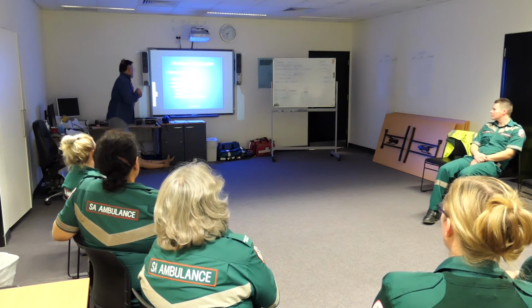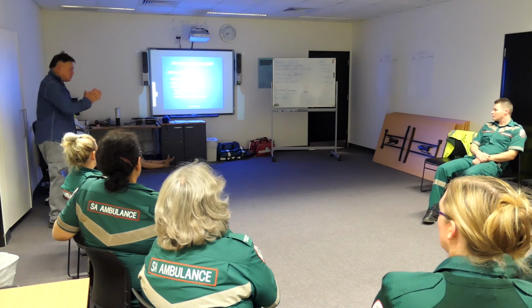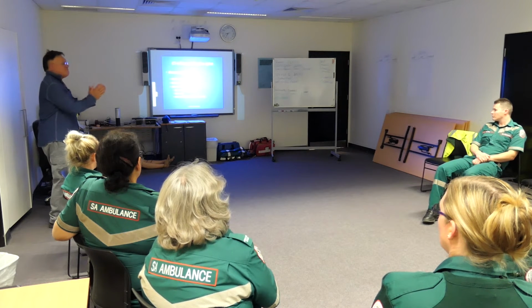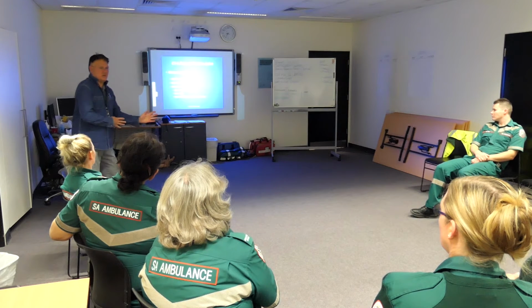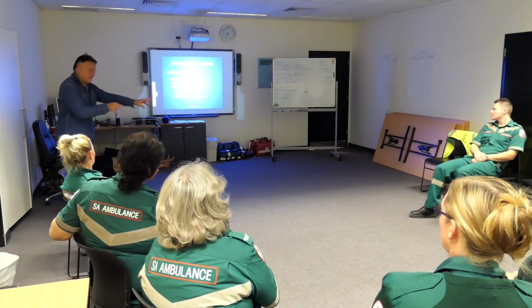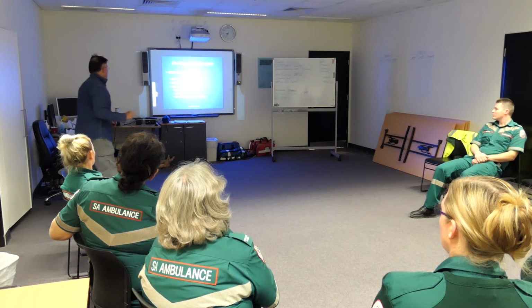Okay, clinical management. In the process of applying this device, one of the things that we want to do is we want initially to have manual stabilization. So if we're working as pairs, and we'll demonstrate that for you, one of us will hold the leg in position so that it doesn't move while we are applying the traction. Because even in applying the traction, you're moving, and believe me, the patient will scream because it's very painful.